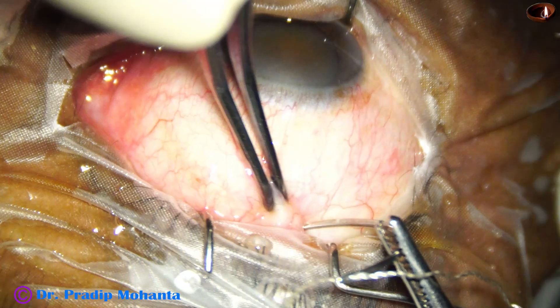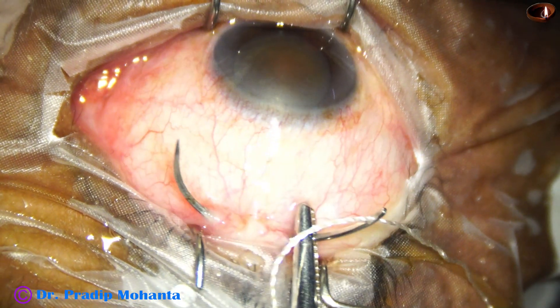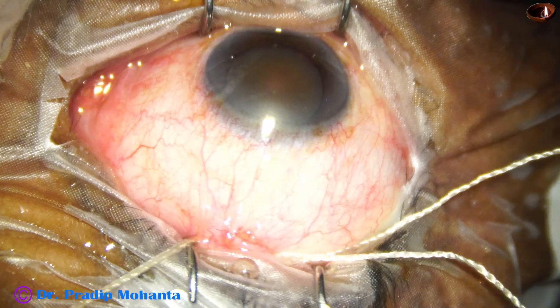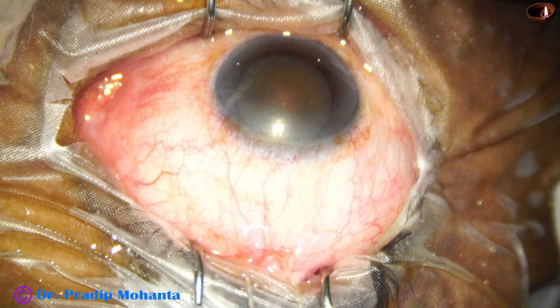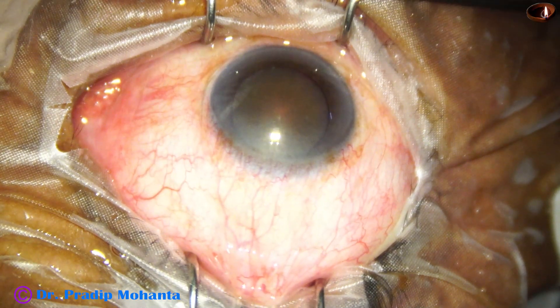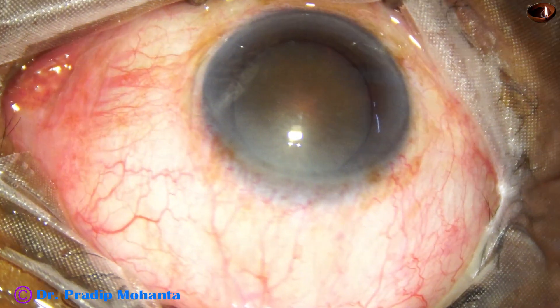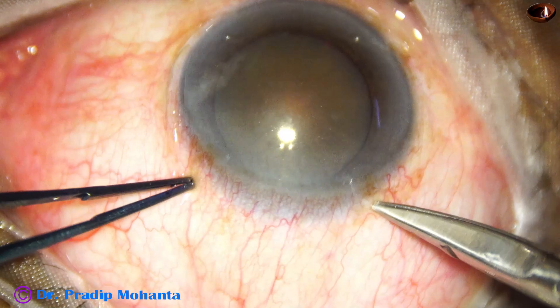This is the superior rectus bridal suture. The eyeball was turned down using a muscle hook. The superior rectus bridal suture is applied and this will stabilize the eyeball, making the sclerocorneal tunnel easier to create. This is particularly necessary for beginner surgeons. Experienced surgeons can do without it.